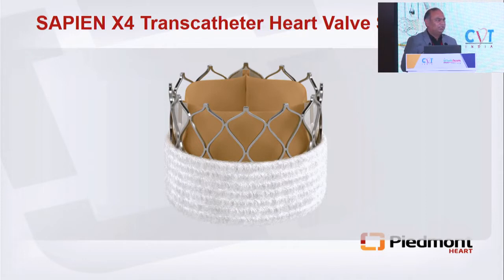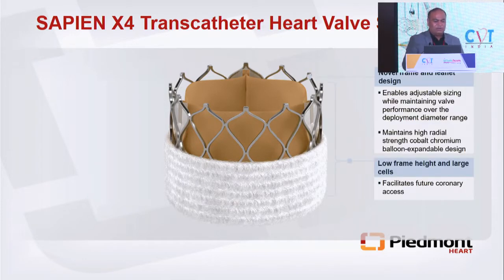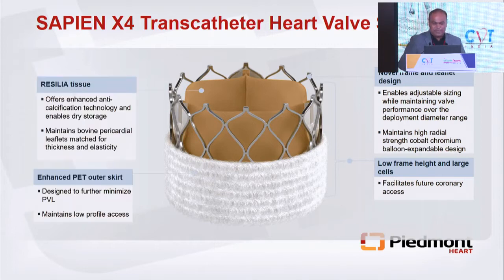That's the next generation of Sapien coming in. As you can right away see, the stent frame is different. It's the same cobalt chromium alloy, but the frame design is completely different. It doesn't foreshorten as much from the ventricle because this is essentially like a coronary stent design. The leaflets are completely new. It's a Resilia tissue. This Resilia tissue is so popular and is being used in the surgical valve Inspiris by Edwards with excellent durability so far. So Edwards has brought in the same Resilia tissue in their TAVR valves.